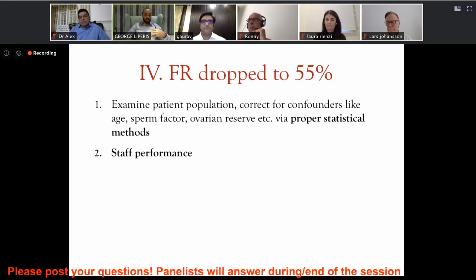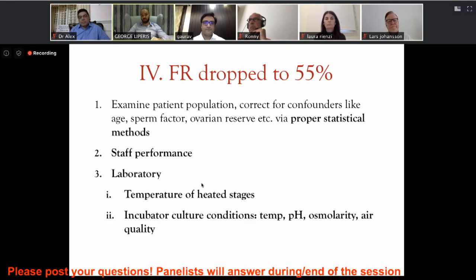So when it comes to the sperm production for IVF, it's very important that we keep good records. You have the laboratory there, but in terms of the production itself of the sperm, the time from production to the time of analysis is very crucial. So we need to see whether we keep records of that, and proper record keeping is very important to see whether there have been delays in the analysis that could lead to dehydration and change of temperatures.